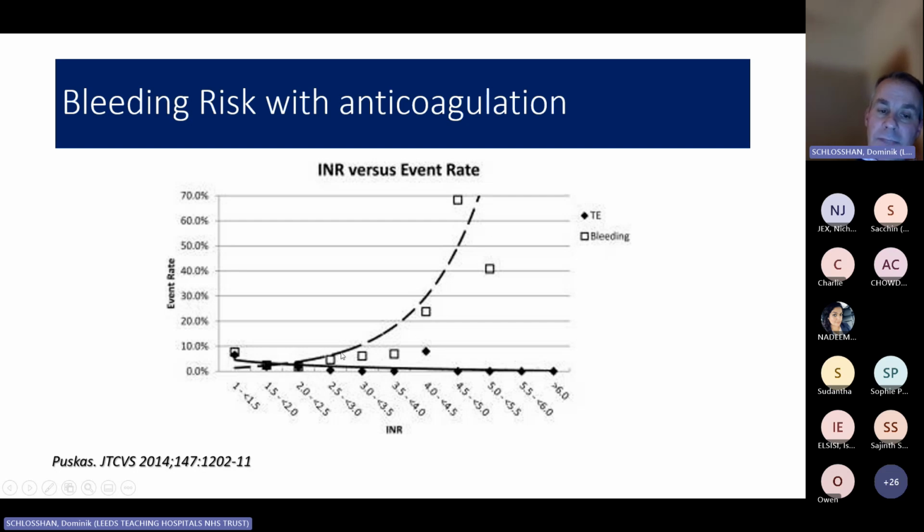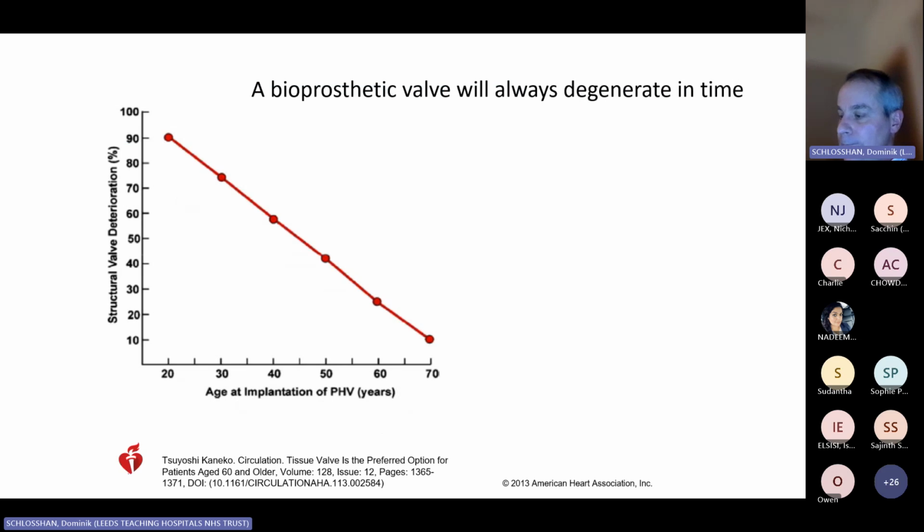And of course, the Onyx valve, we know it has an INR target around here, just below 2, with aspirin, and their bleeding risk is really quite small, isn't it? So I think the bleeding risk is there, but actually it's probably slightly overrated, and with the newer mechanical valves, probably isn't as much. So I'm not a big seller now of the mechanical valves, because it is really a patient choice, and you do need to have warfarin, but equally one just has to look also at the evidence. Okay.